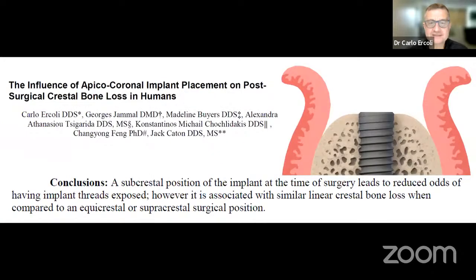cause the resorption of that crestal bone as a function of the formation of the biologic width, which we said is about 4 millimeters. So whenever you place a so-called bone level implant, you really do not want to place it just at the level of the bone, because the moment you lay a flap, you're going to lose a little bone.